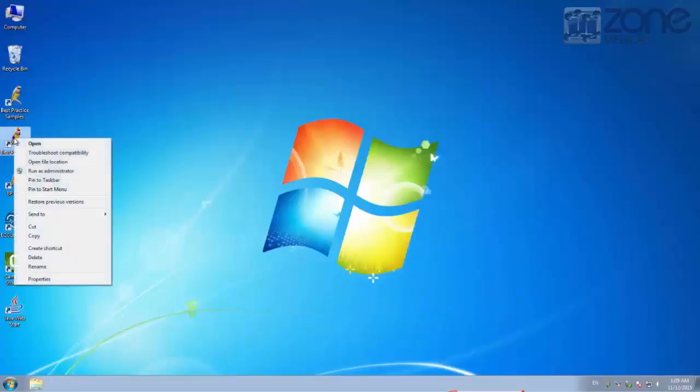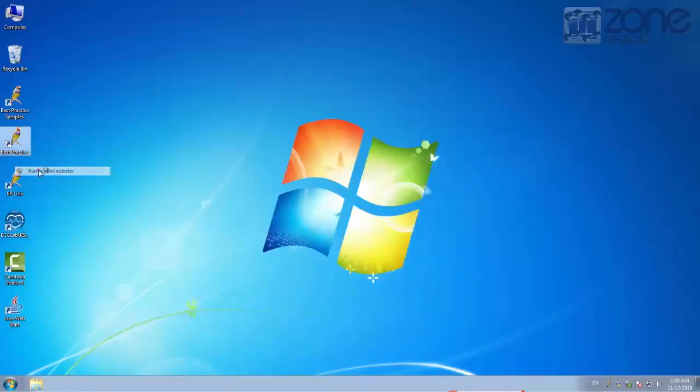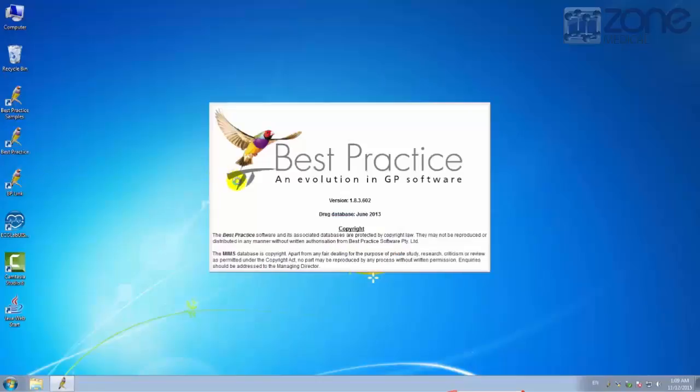Once you have done this, you can open up the Best Practice software. Make sure you run as an administrator to use the software properly.